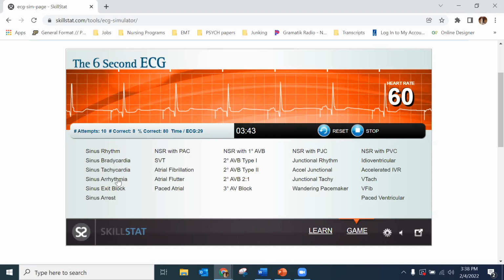Yeah. So like you said, if your patient's on a pacemaker, you have something called a pacing spike. It's a very, very straight line. They're pretty obvious. A lot of the times they're a different color as well. At least where I've worked before, my EKG rhythm was white or green and my pacing spike was yellow. It's a very straight line to indicate that your pacemaker has discharged.